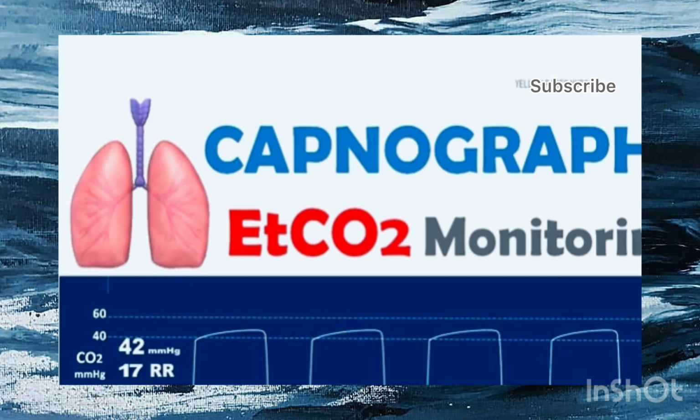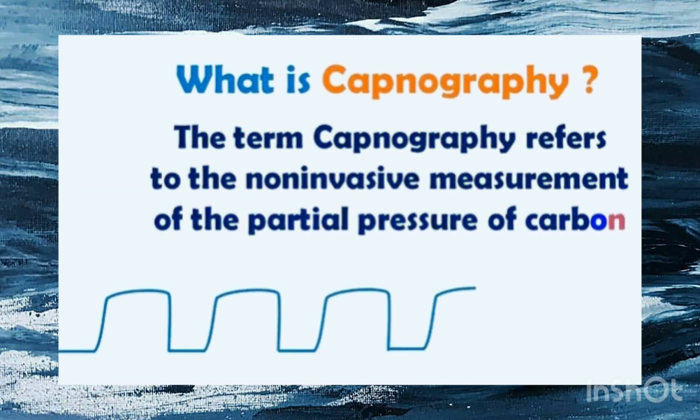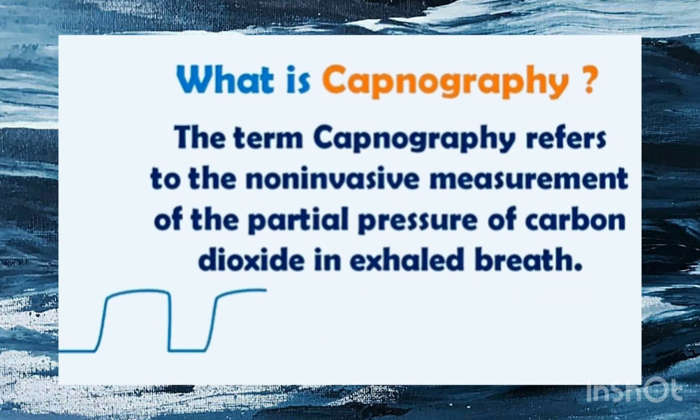Let's get into the topic. What is capnography? The term capnography refers to the non-invasive measurement of the partial pressure of carbon dioxide in exhaled breath. Moreover, it provides a breath-by-breath analysis and a continuous recording of ventilatory status.